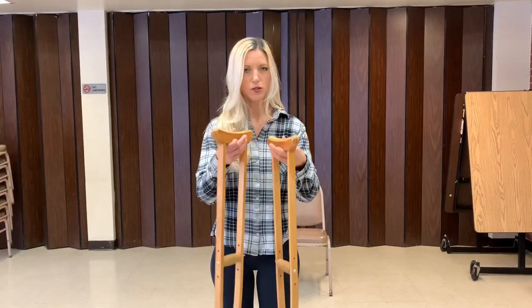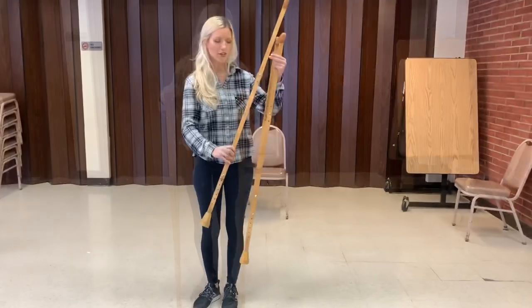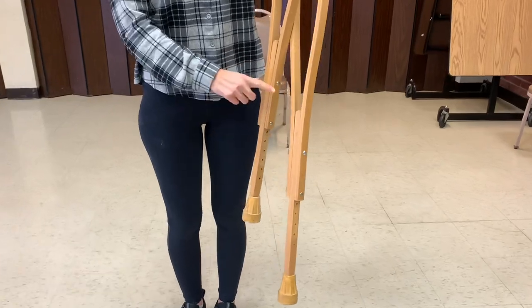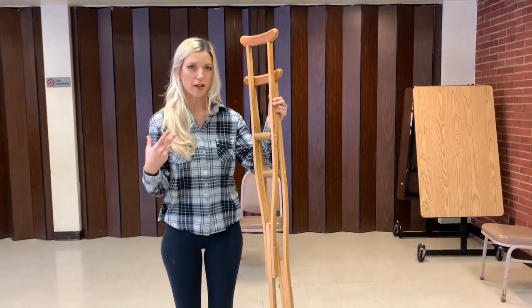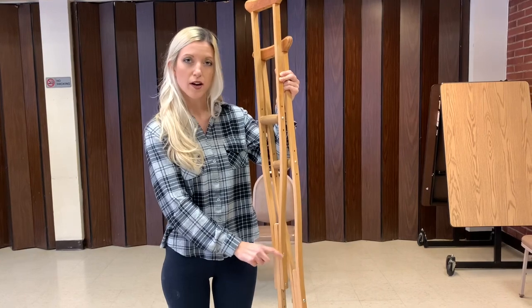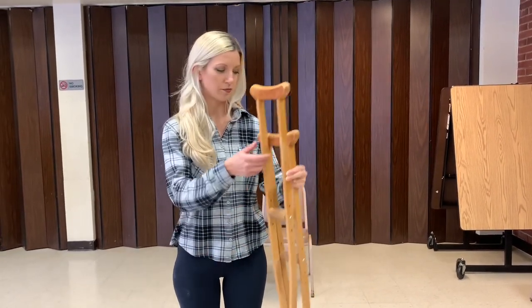So this is an older pair of crutches. I already have them sized to my height. On these older wooden types, you have to undo the bolts and adjust it to your height. And you also have to adjust the hand grips. On the newer crutches, they are made out of aluminum. It's just the push of a button, and usually there's a height marker on there, and it's much easier to adjust to your height.